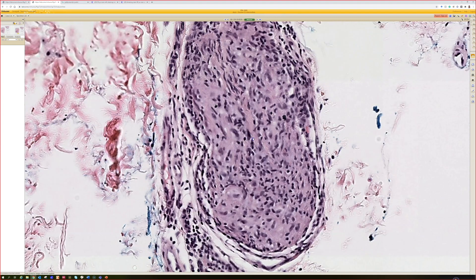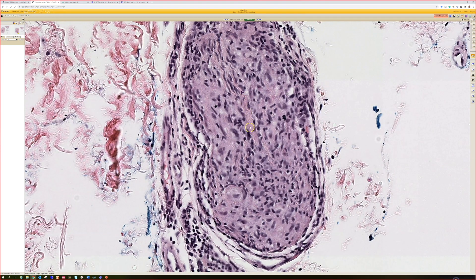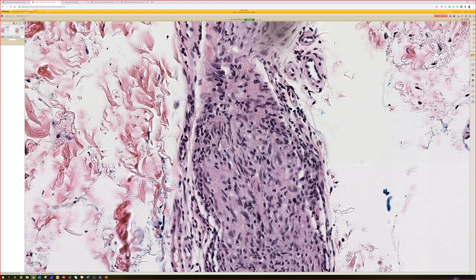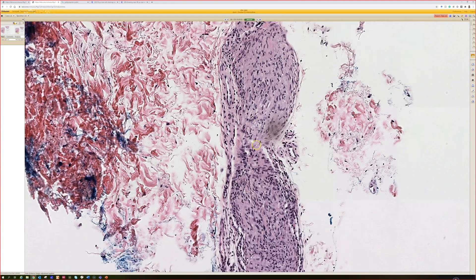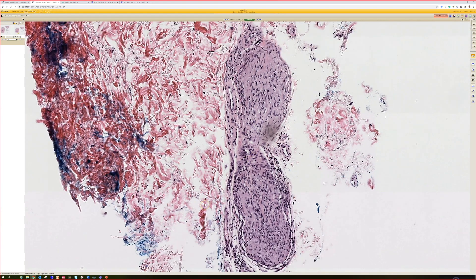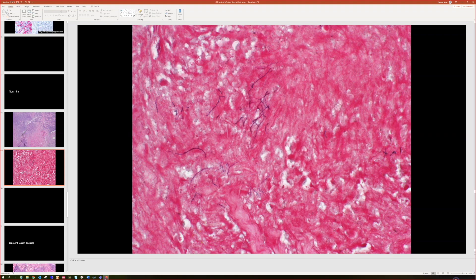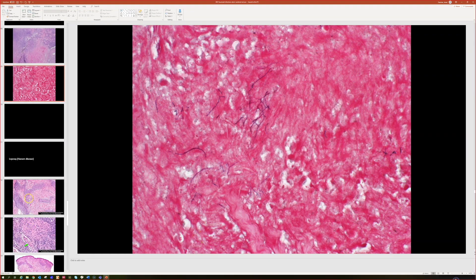Here's one that I think is actually around a nerve more obviously. This slightly wavy collagen structure in the middle probably represents a small nerve, and the perineurium is totally distended by histiocytes — a tight granuloma tightly cuffing around the nerve. It's kind of linear and elongated, which is classic for tuberculoid or paucibacillary leprosy.